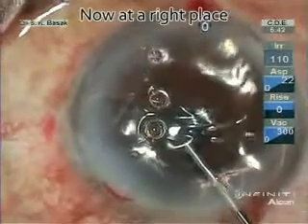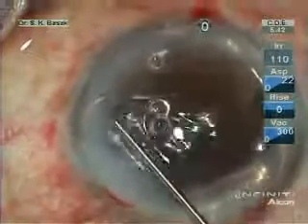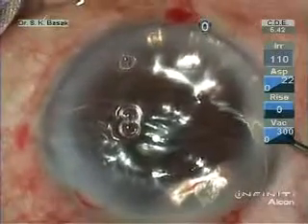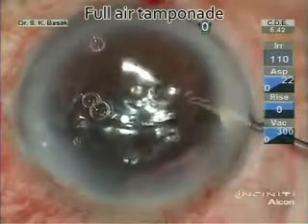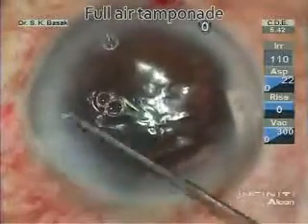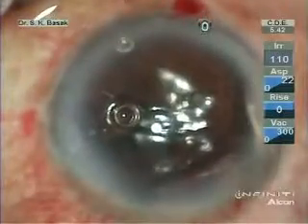Further manipulation via the main port to inflate the anterior chamber. More air was injected via the right hand side port to give full tamponade. IOP checked and kept at a higher side. Air bubble was removed partially after 1 hour and replaced with balanced salt solution.